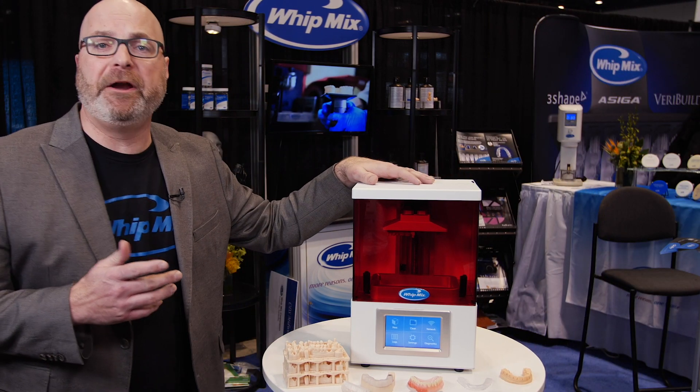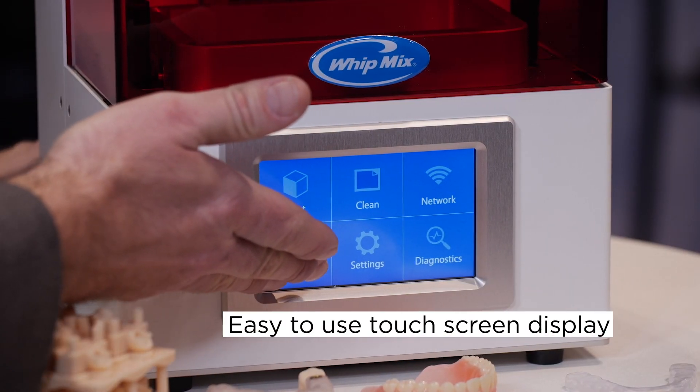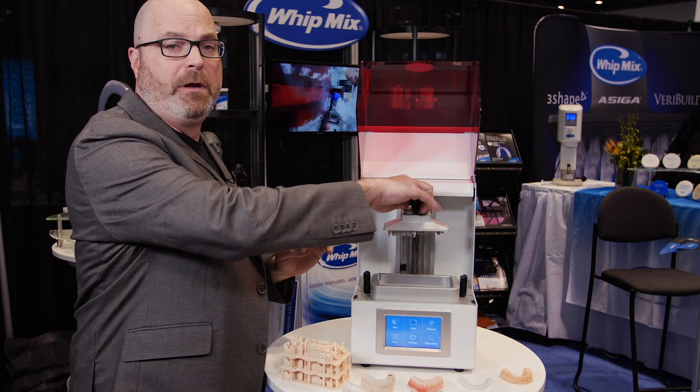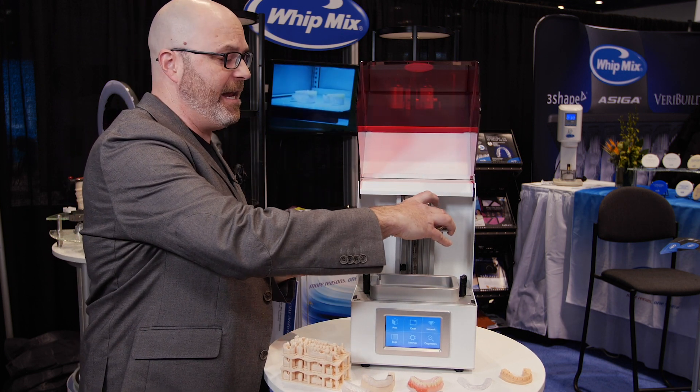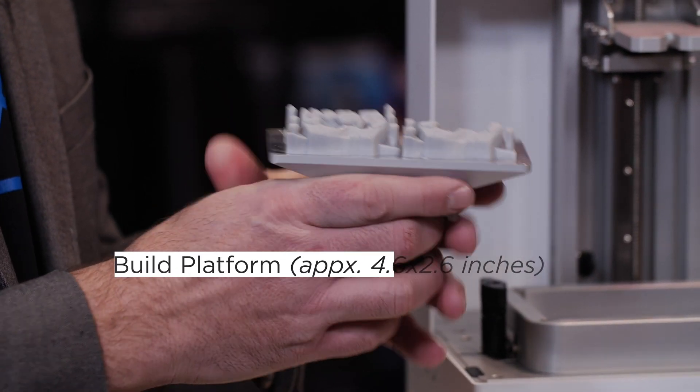It is an LCD printer with a very easy-to-use touchscreen display. As we open it up and get under the hood, you can see that it has a print envelope of approximately 4.6 by 2.6 inches.